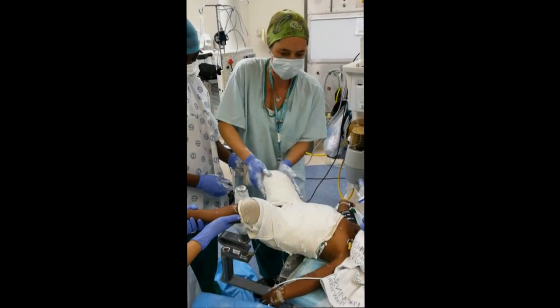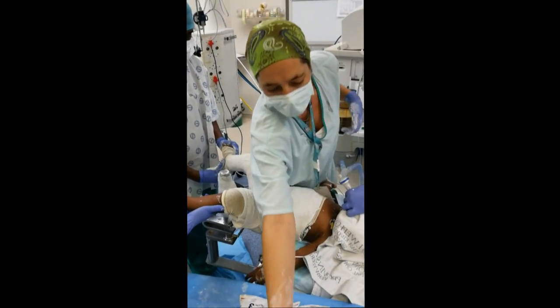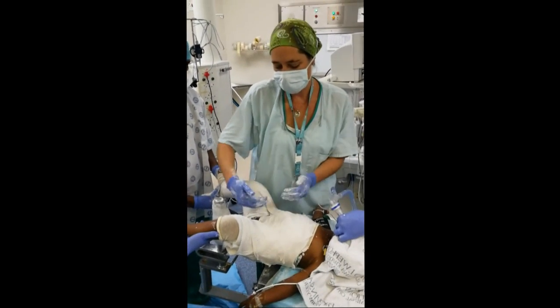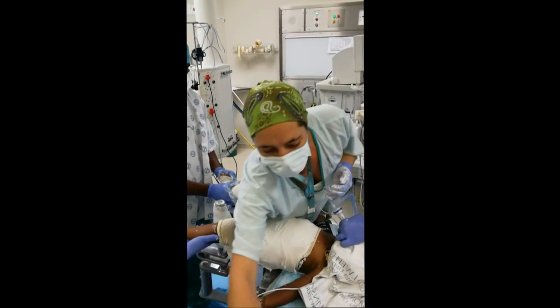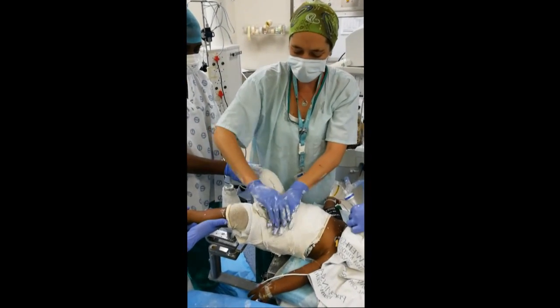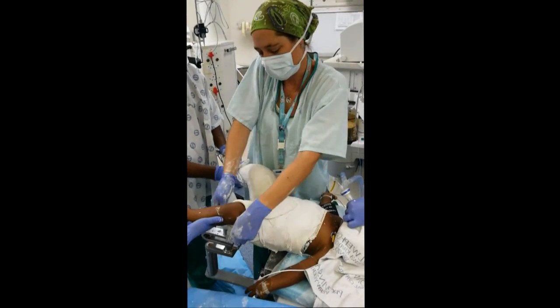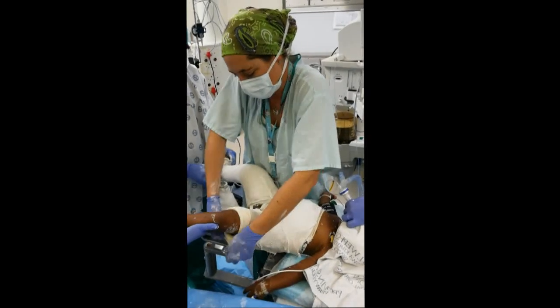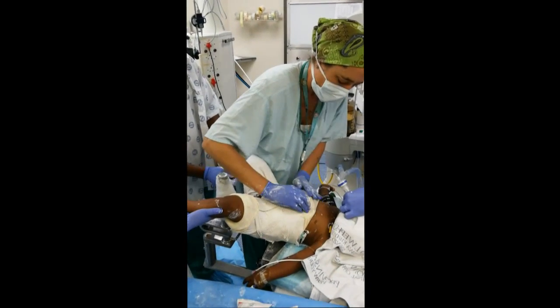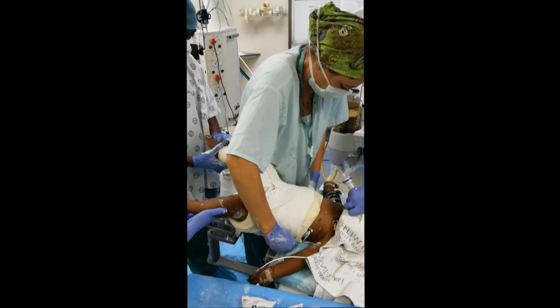These are the little 50mm slabs made at the beginning. Put them in each corner to reinforce it. As you can imagine, the corners are the weaker spots where the spica can break. Don't put too much plaster of Paris because somebody has to remove this cast later, and it's not fun if you've put on very thick layers. Now you can start rolling over your edges for a nice finish. Parents often complain about hard edges, especially around the chest, so just be mindful of that.